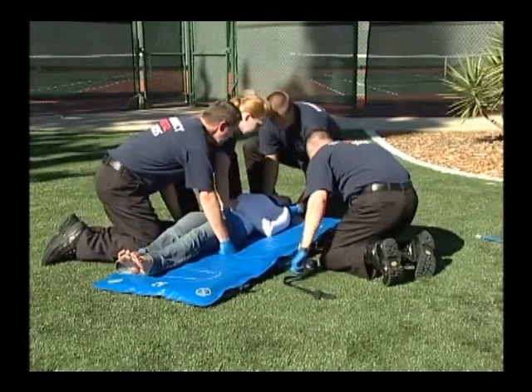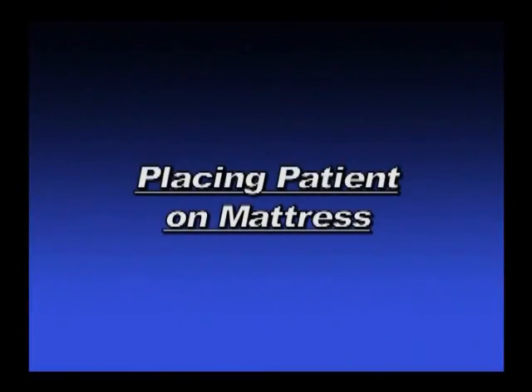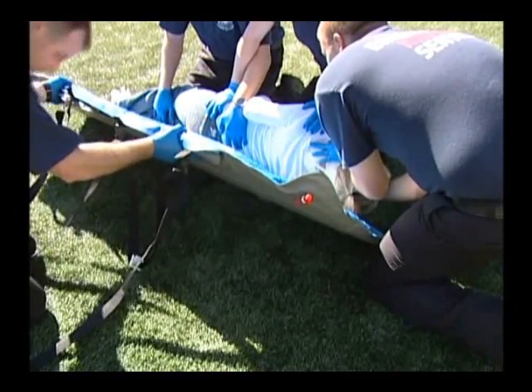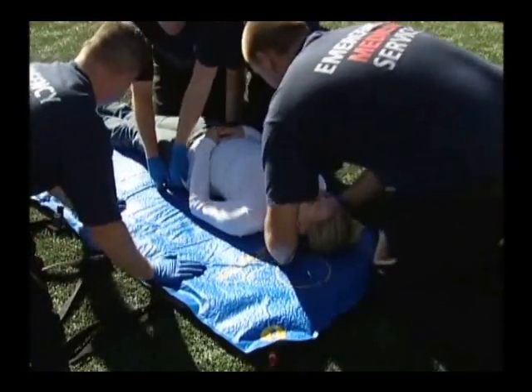With the correct amount of evacuation, the mattress surface should be smooth but not excessively dimpled. Place the mattress next to the patient with the first buckle in line with the patient's axilla — their armpit. The first buckle is positioned just below the head and shoulders logo on the mattress.